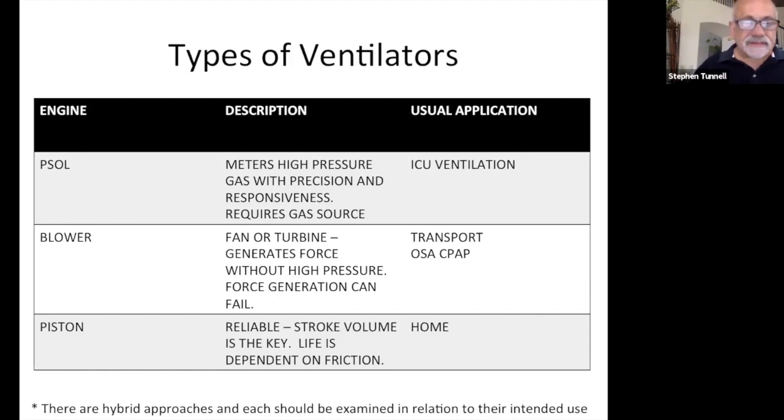So that's a blower-based ventilator. Many blower-based ventilators are in the mid-range of pricing. So we said 30,000 for the high end. I'm going to say 22,000 for the blower-based units, somewhere in that neighborhood.